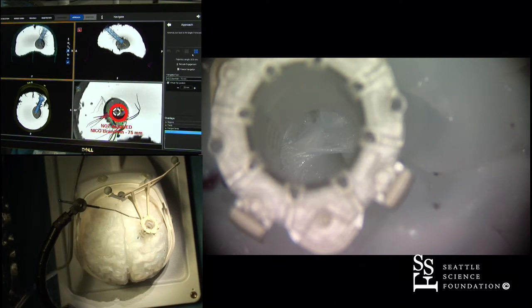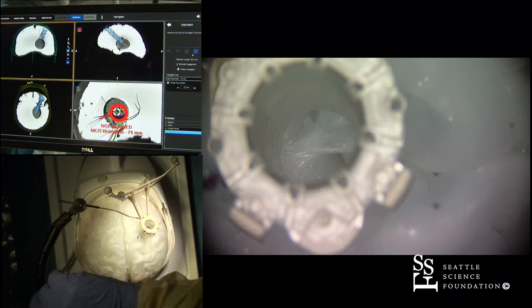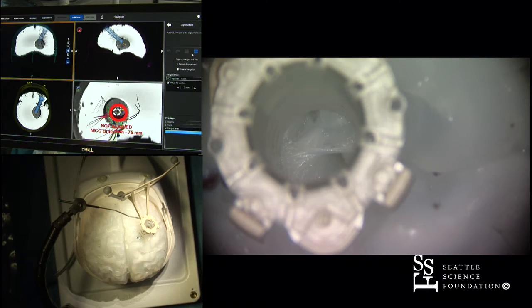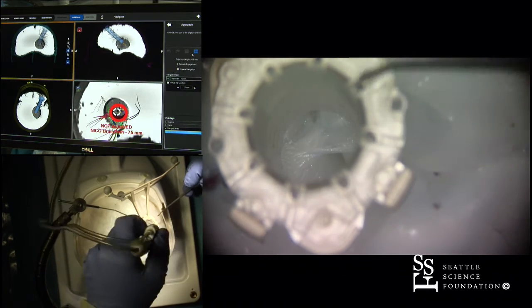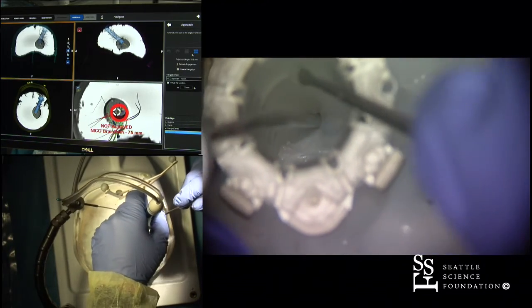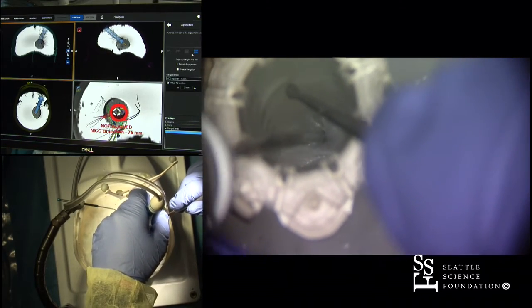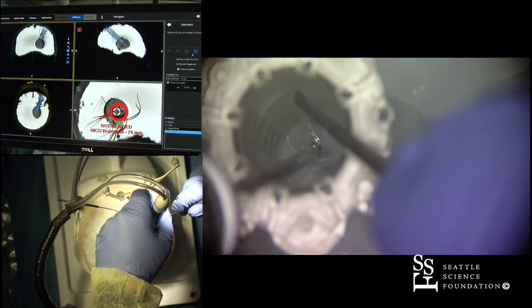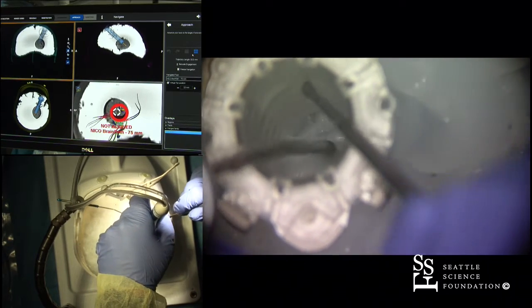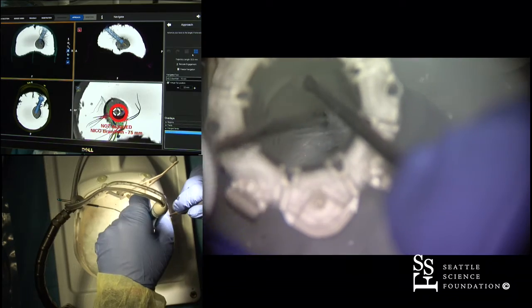Do you have something like a bayonet — something I can play with like it's a bipolar? At any rate, we're going to work down the tube. We have our suction only, and then we kick over to the resection. Then you can see that we can resect tumor — like I showed you in the video — and I have a bipolar in my other hand.